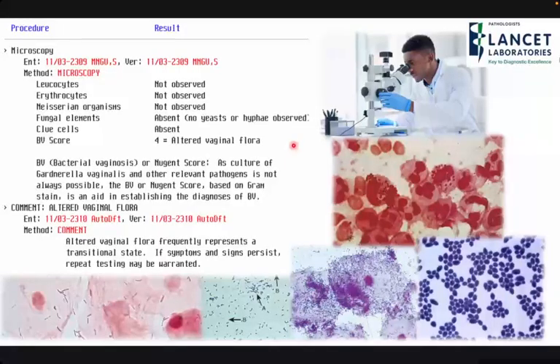that we have. So a sample comes to us, and it has to come as soon as possible because we have fastidious organisms such as your Neisseria gonorrhoeae. And when it gets to the laboratory, we'll do microscopy. And so we'll do a smear and look at these slides under microscopy. So what we mainly look for is Neisseria organisms and fungal elements.